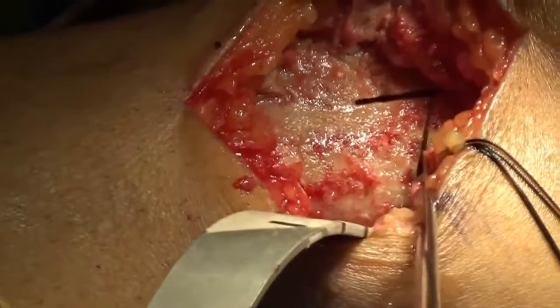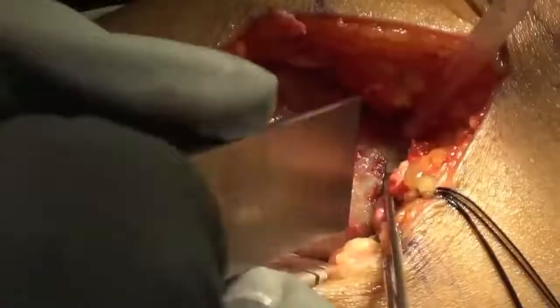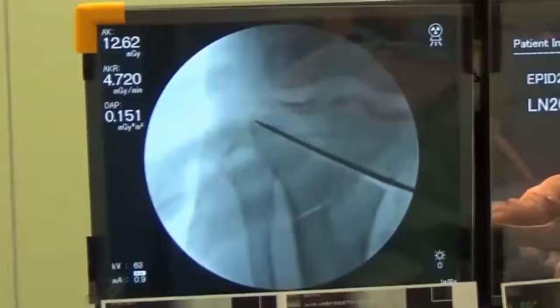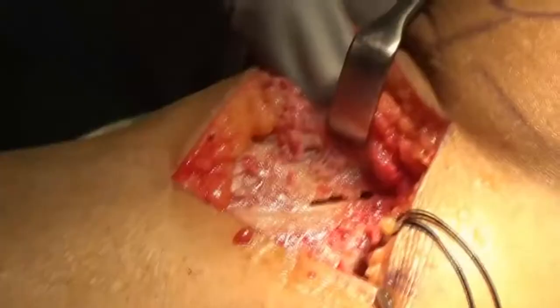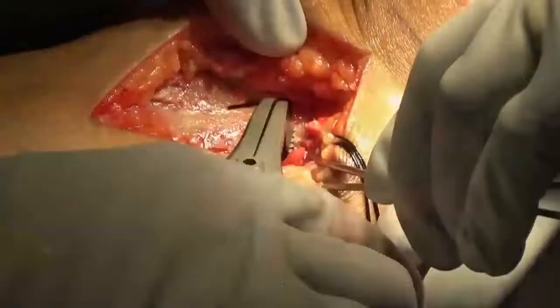After elastic movement at the osteotomy site is checked to ensure completion of the osteotomy, several chisels are inserted into the transverse osteotomy site. Opening of the osteotomy site is visible under fluoroscopy and also through the incision. During opening, interfaces at the arc osteotomy site are slid around the hinge position and kept in contact with each other.